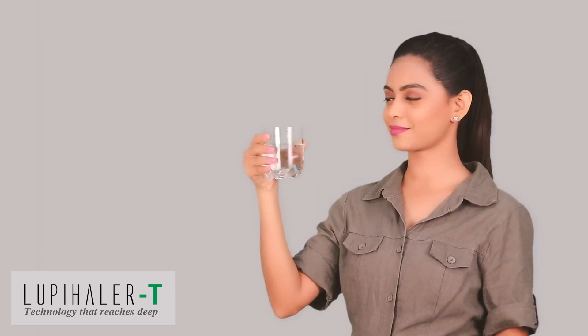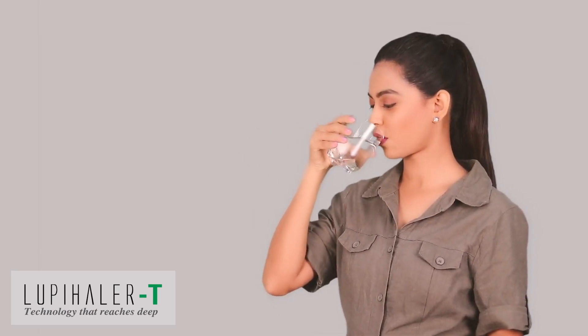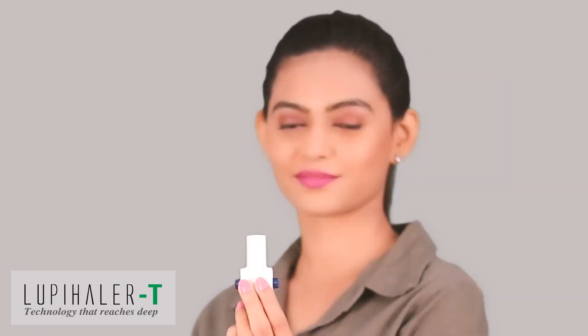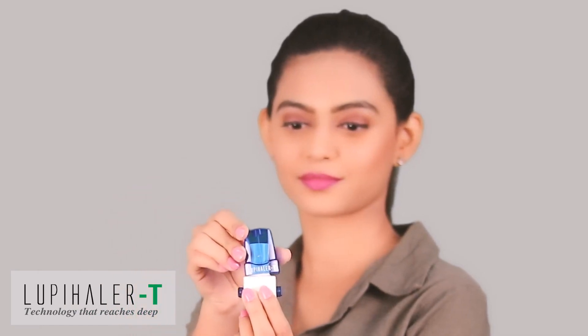Rinse your mouth with water after completing the inhalation, but do not swallow it. Put the dust protecting cap back on the Lupehaler T.